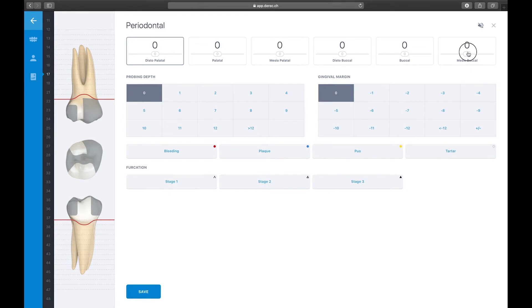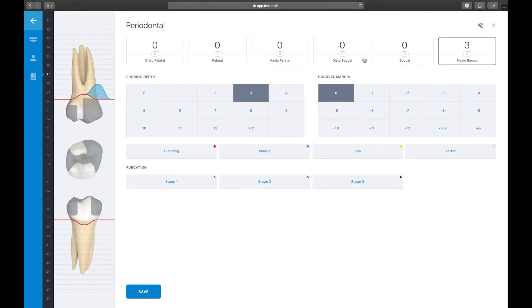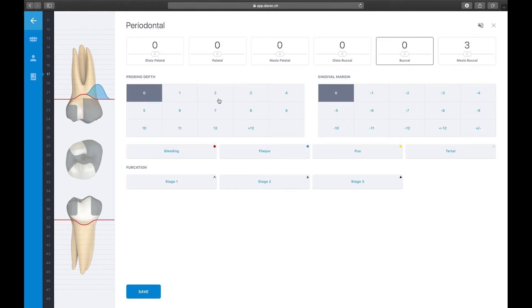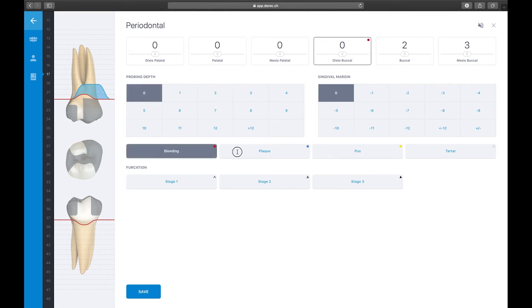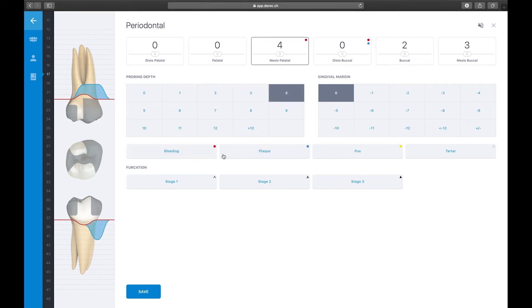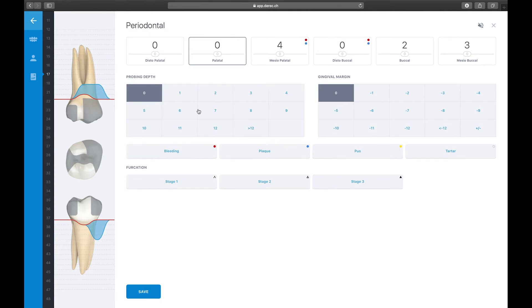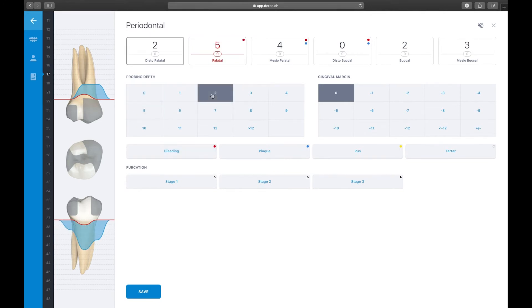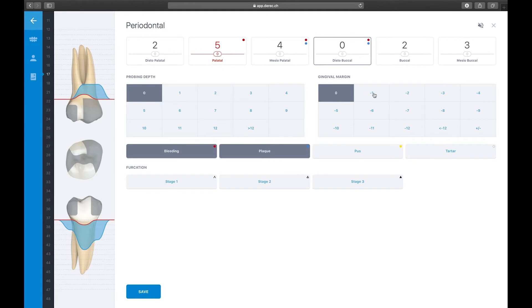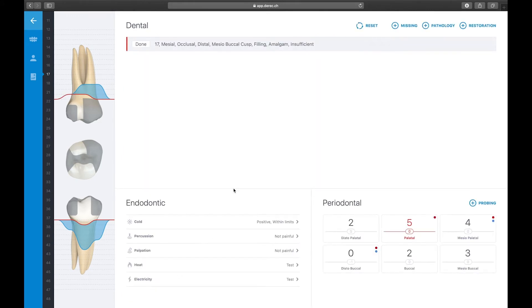Let us quickly enter some data. First, select the measuring site where you want to add your recordings — for example, mesio-buccal. Then enter your probing depth. If you observe any bleeding, plaque, pus, or tartar on the site, enter these findings using the respective buttons. Record any recession or hyperplastic gum line if present. Hit Save — done.